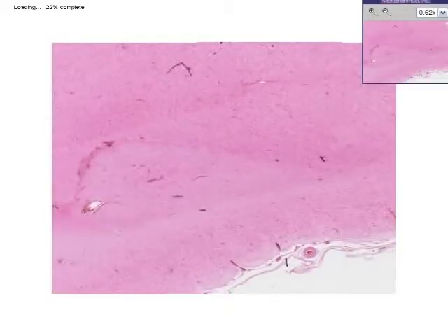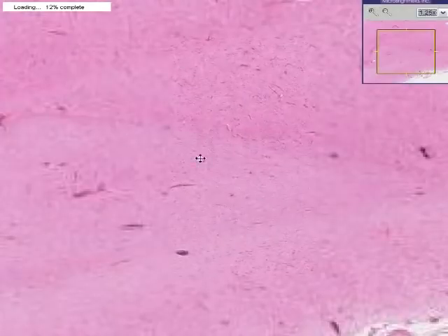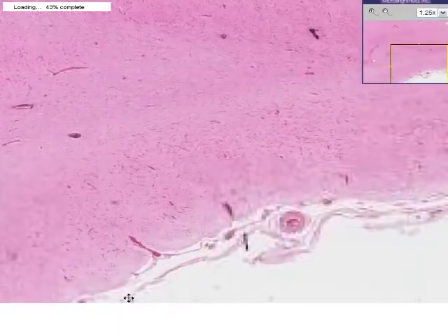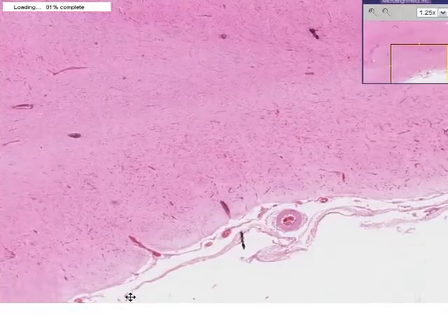Okay, let's say a few general words about inflammations of the brain and meninges, and then we'll show some of the classic features of inflammations of the brain, otherwise known as encephalitis. As you can see from this view already, the substance here that we're looking at is brain, and at the periphery of it you see a loose membranous and vascularized area, which is meninges.